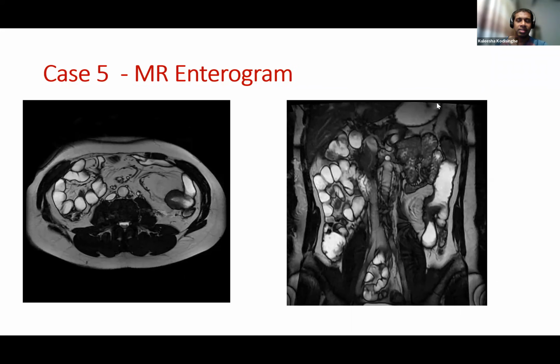Yeah, there have been some questions sent in, almost all for Iranga. The first one is, in acute pancreatitis, would you recommend CT within 48 hours for the purpose of diagnosis? Just for the diagnosis, please wait for 72 hours, because even at 48 hours you might not see the change. If it's just for the diagnosis, please wait for at least 72 hours.